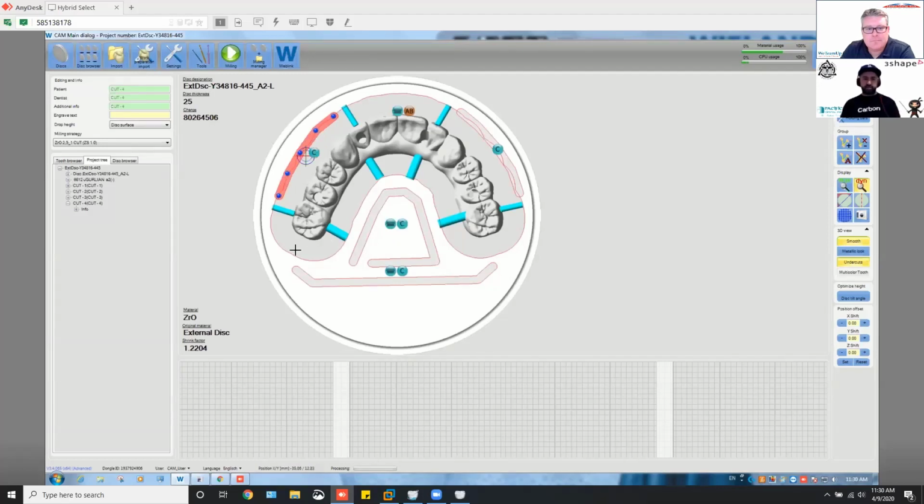Now these are just obviously with this software. You may not be able to do this with some 3D, or I know Hyperdent's much more where you can actually expand it all the way and take the disc and mill the disc down 2-3 millimeters, getting rid of that. So each software is a different way, but I'll add this, and like this cut spline to create the support brace, it's actually going to come in here and cut this.